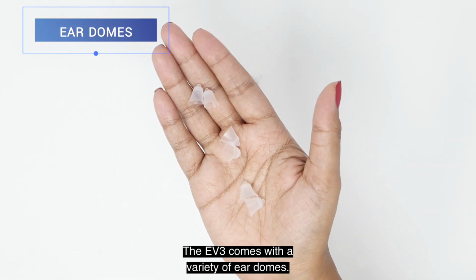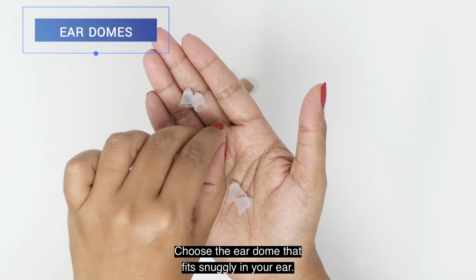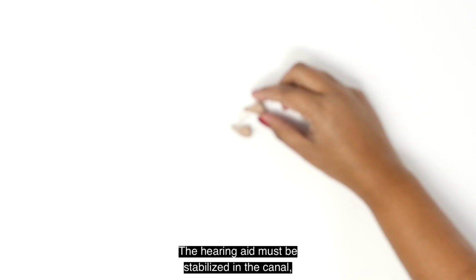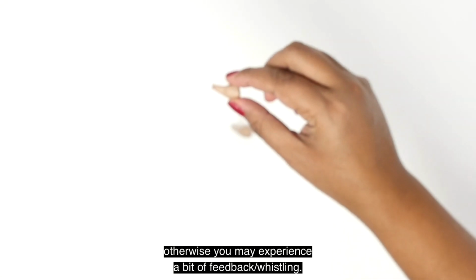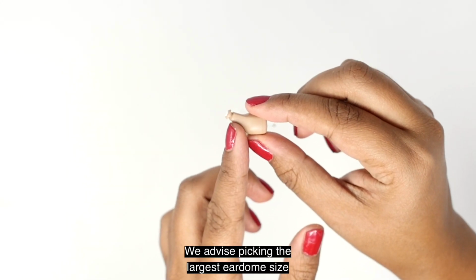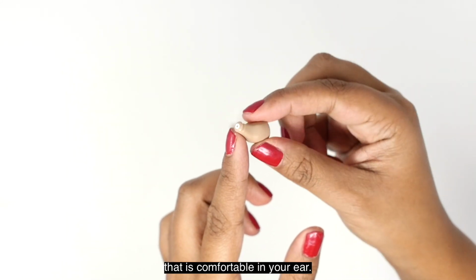The EV3 comes with a variety of ear domes. Choose the ear dome that fits snugly in your ear. The hearing aid must be stabilized in the canal, otherwise you may experience a bit of feedback or whistling. We advise picking the largest ear dome size that is comfortable in your ear.